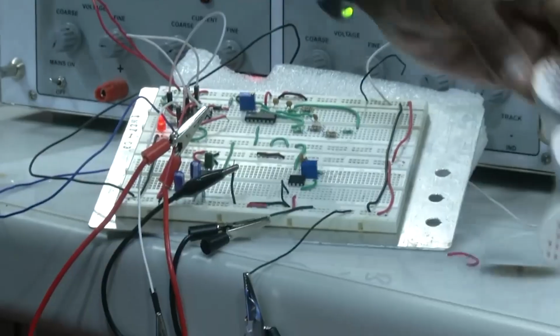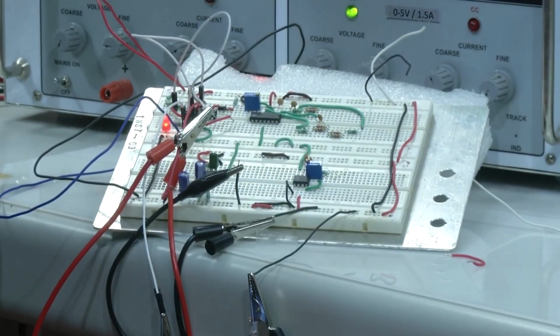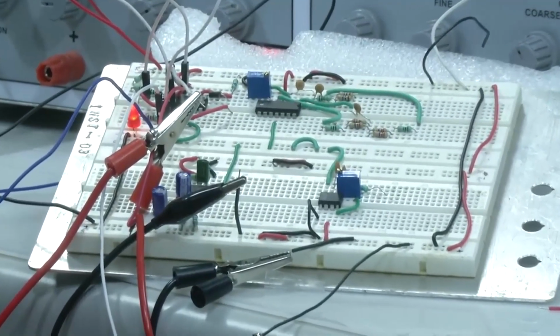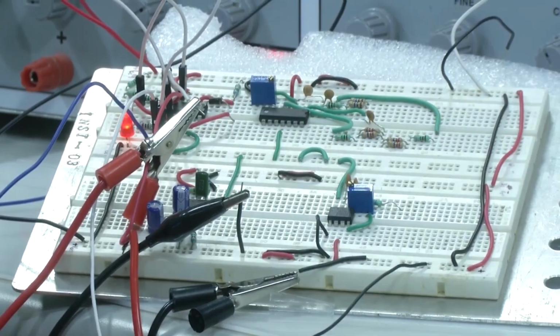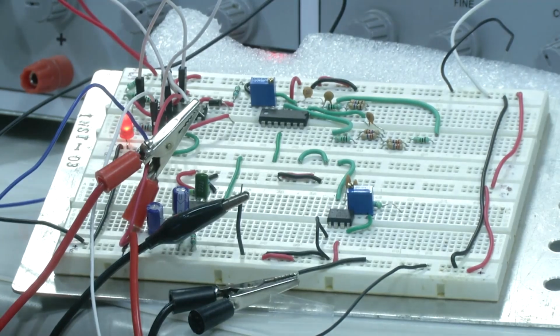Then we will pass it through an amplifier for amplification of the ECG signal. Unless we do the amplification, it is very hard to detect using our normal DSOs, because the amplitude of the actual ECG signal is very small. So, in order to improve our signal ratio, we are passing it through the instrumentation amplifier, then we will pass it through filtering, so that we can easily visualize whether the signal has been filtered or not.